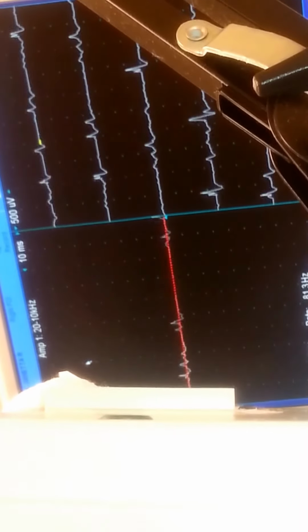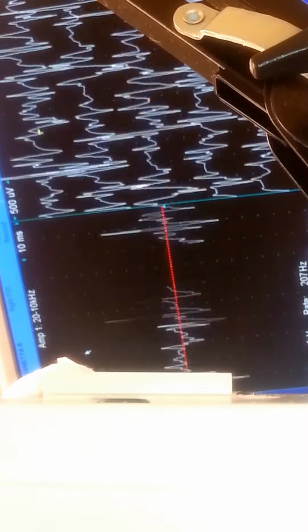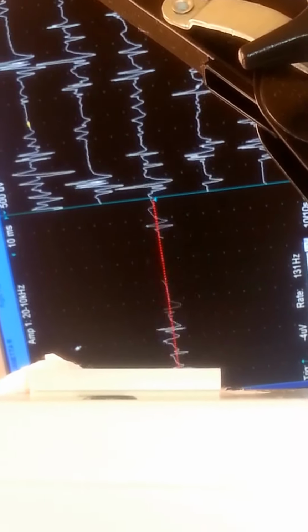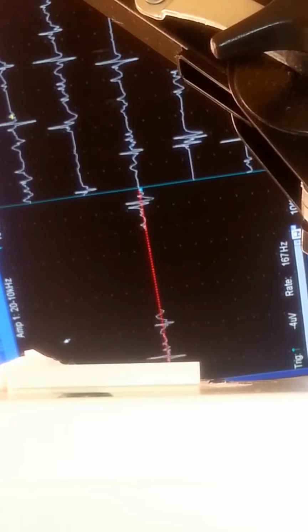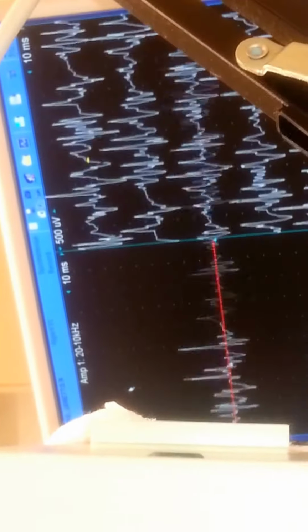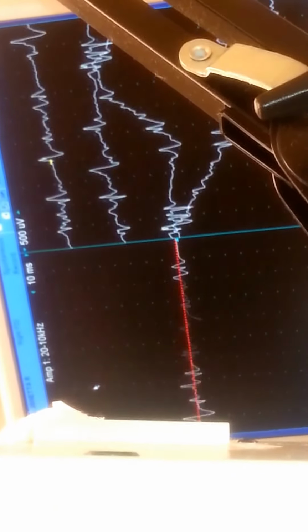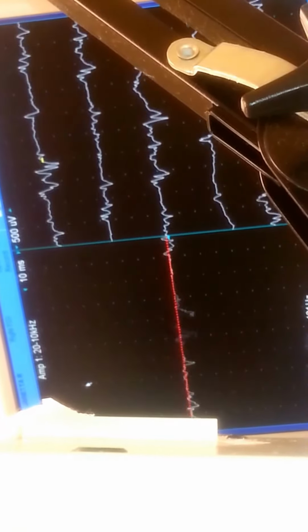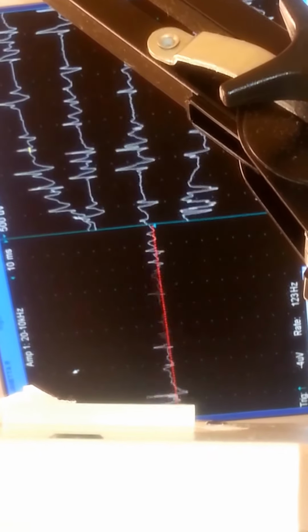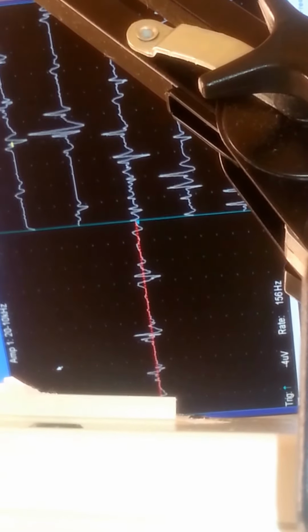Hold your finger right there. Push up hard. Good strength. Now slow it down. Those are nice. Push up hard. And you fill the screen. Push up again. Good. I like those. You start small. Just want to get a good screen. And they're skinny. Good. One to go.